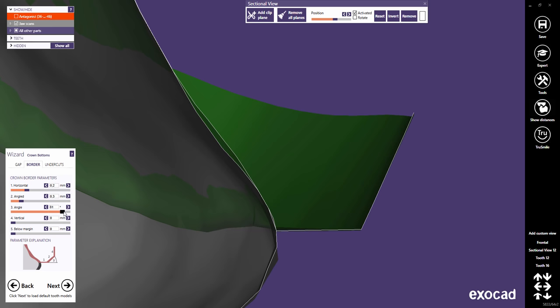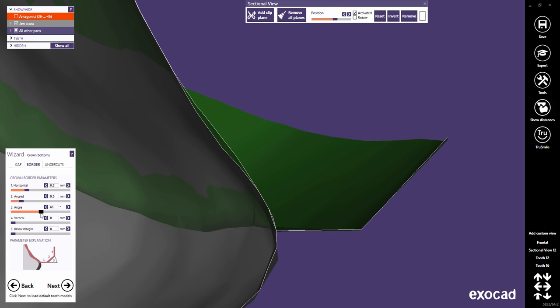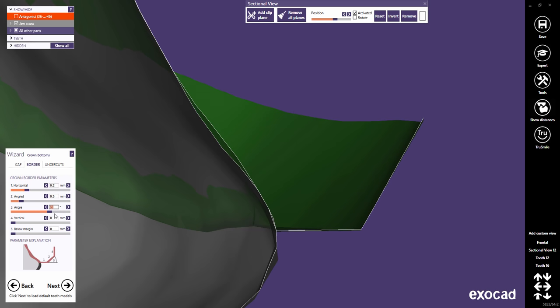Angle defines the angle for the angled part. Vertical defines an additional vertical border — commonly, this value is also set to 0. Below Margin defines an absolute offset for all the drawn margin points in the insertion direction.